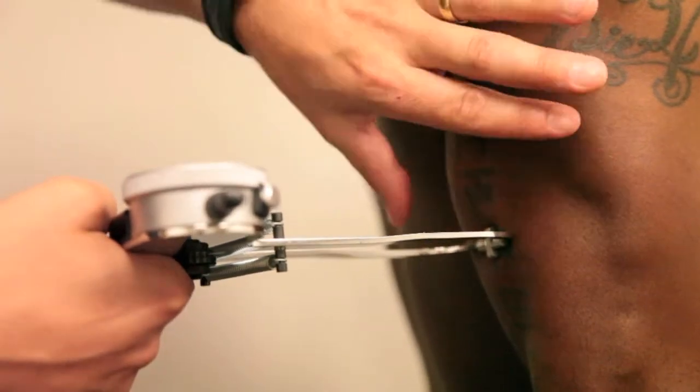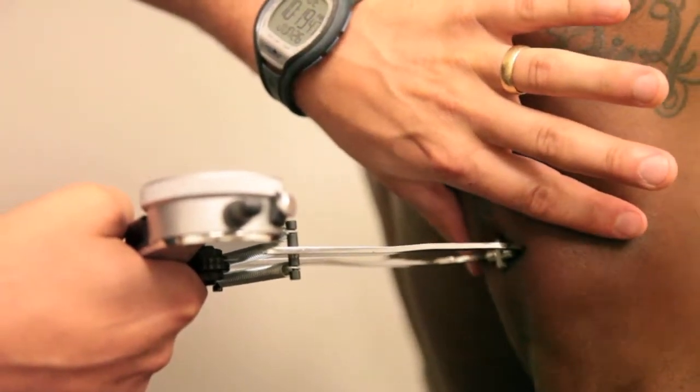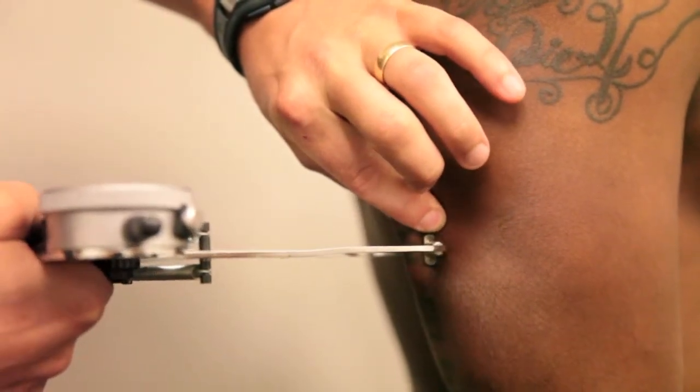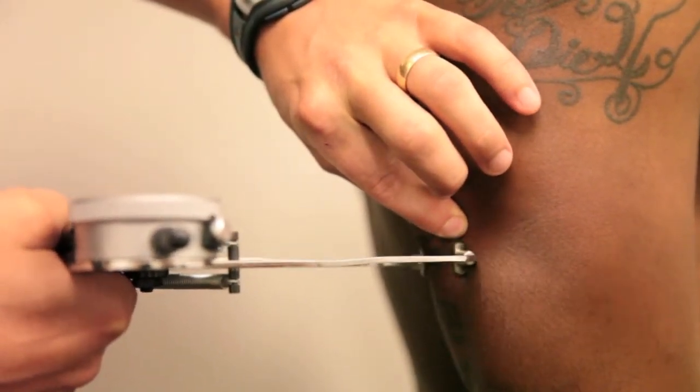We'll do it one more time. I'll have you contract. On the site, relax your arm, squeeze with the index and thumb, place it about midway on the fold, take the reading, open and then let go of the site.